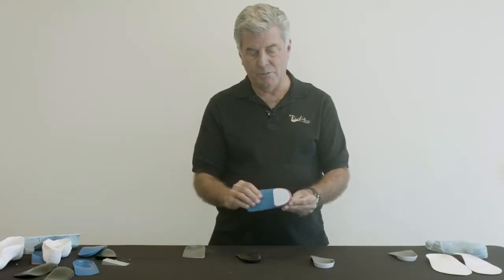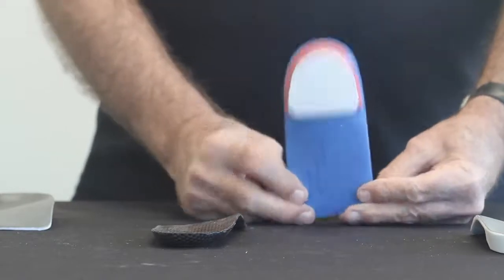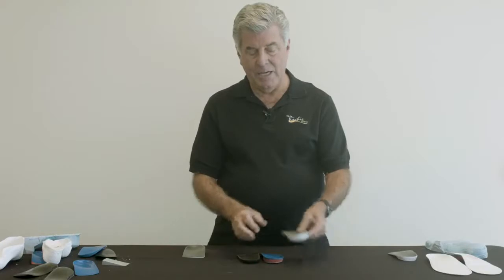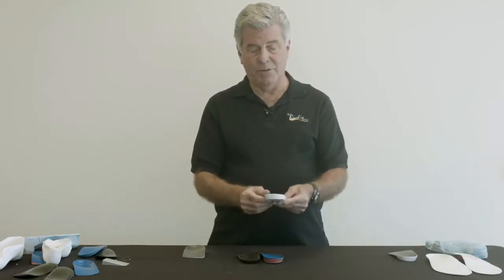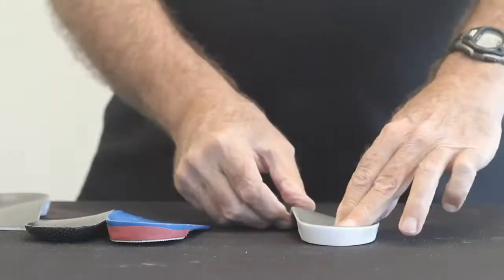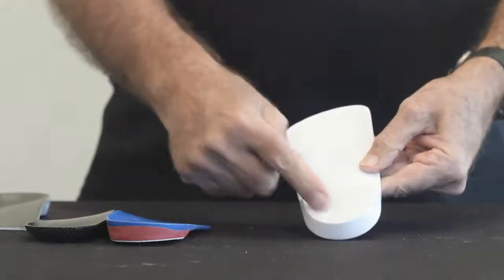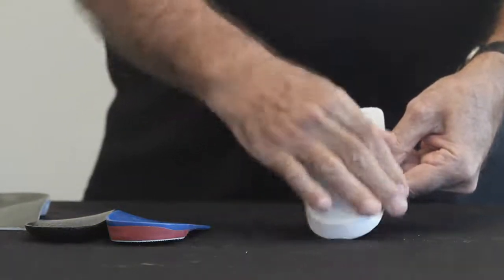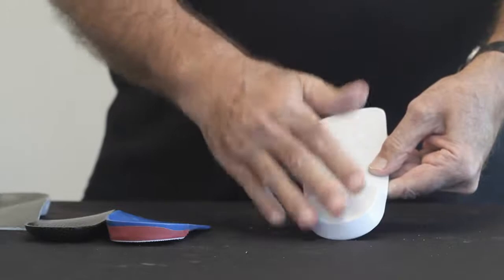Because it is a separate device, we call this an extrinsic rear foot post. An innovative way to apply a rear foot post is the intrinsic posting technique. This post is actually part of the shell itself — it's integrated into the shell as one unit.